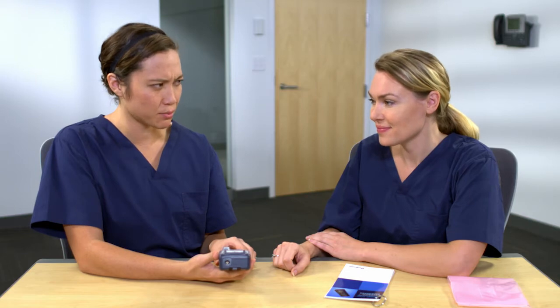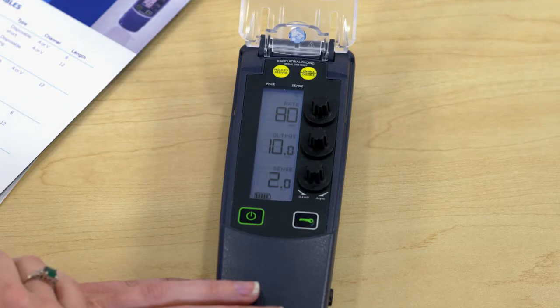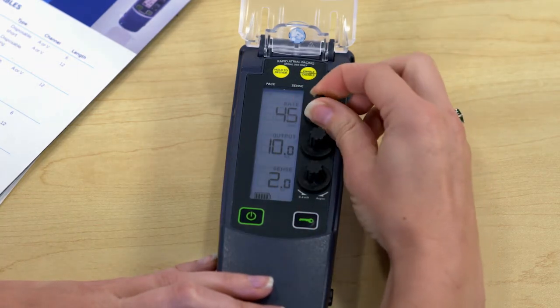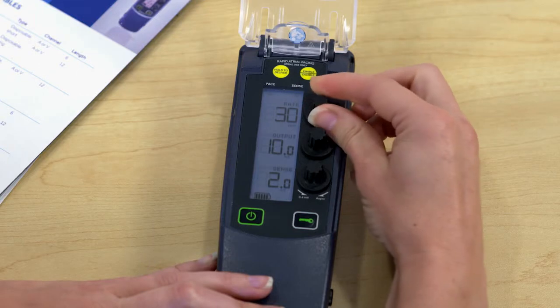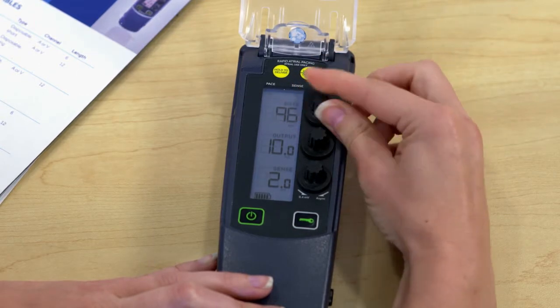I've used other external pacemakers previously — are there any differences I should know? Yes, there are some enhancements on the 53401 temporary external pacemaker. There is an LCD display, and as you turn the knobs, you can hear and feel the clicks. There's also more range with the programmable parameters. The pace rate may be programmed from 30 to 200 paces per minute.